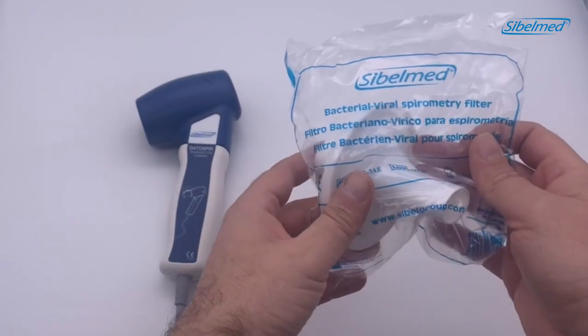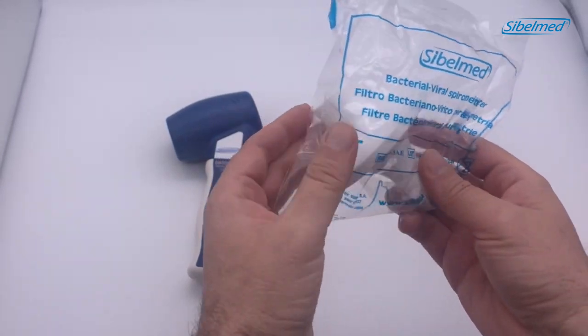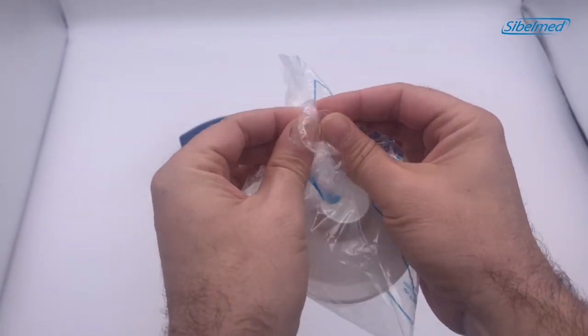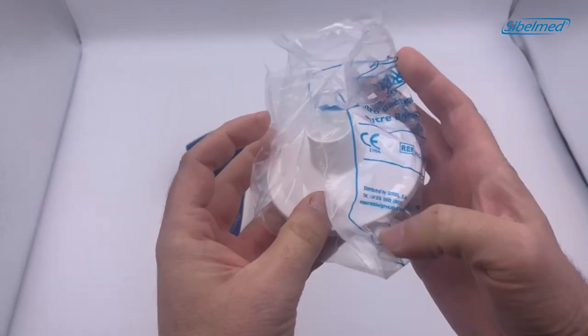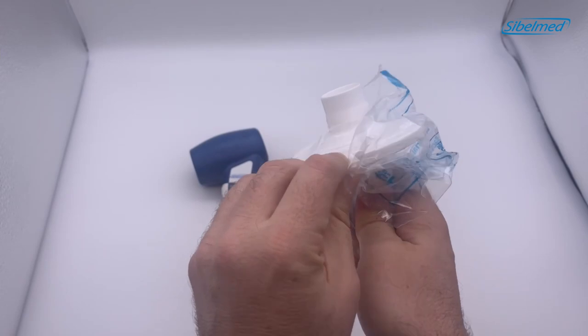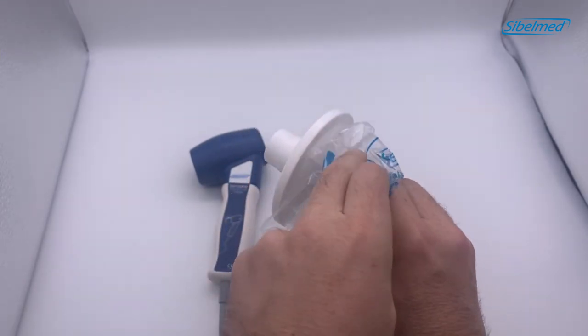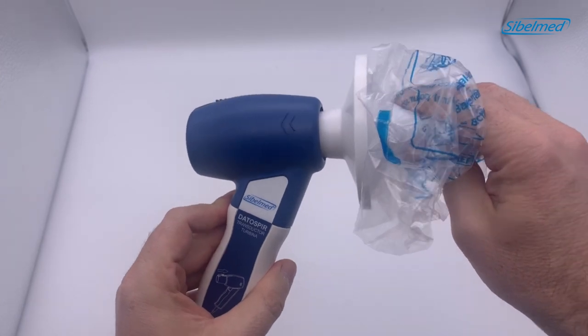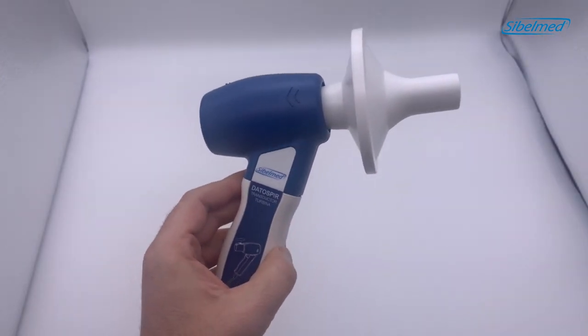We will use a bacterial filter on the transducer to avoid any cross contamination. Open the plastic bag leaving the oval outlet inside. Connect the filter to the transducer and then remove the bag. The spirometer is now ready for the first maneuver.